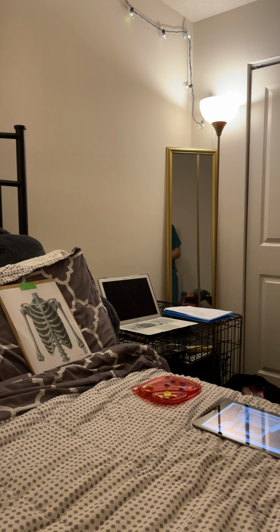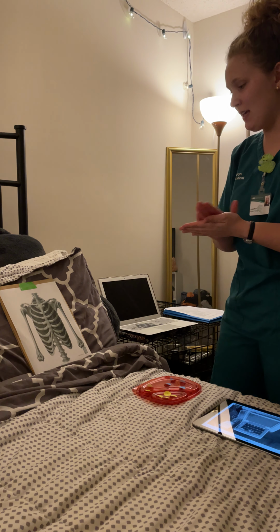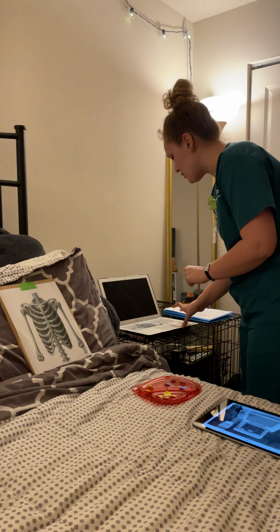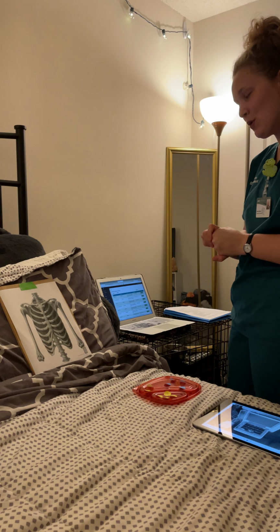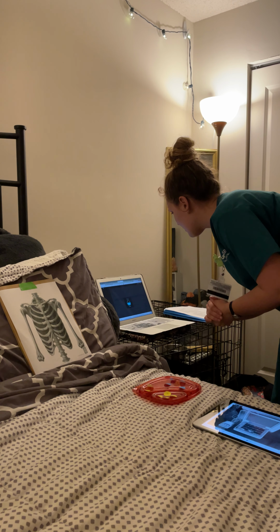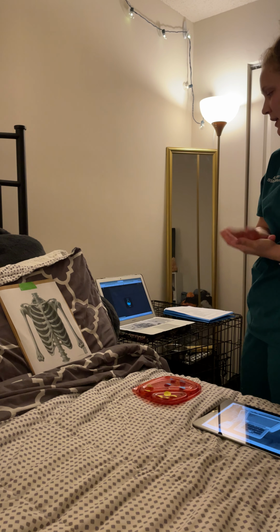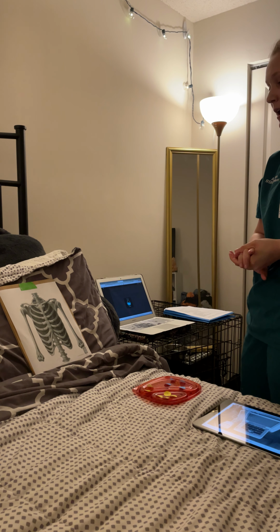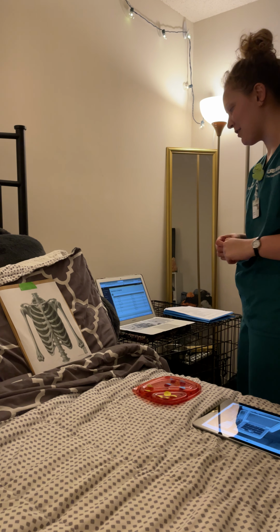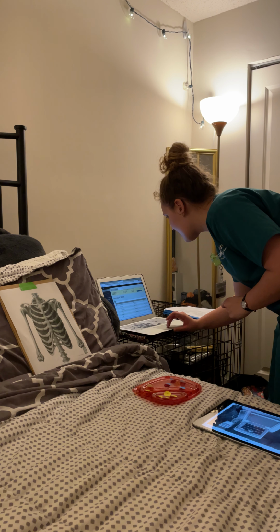Knock, knock, knock. Hello, Mrs. Gee. I'm Molly. I'm going to be the nurse taking care of you today. I am going to look in my computer real quick, and we'll get you started. I'm here to do an EKG, a 12-lead EKG on you today. You probably had one when you first came in, but we're doing another one today. So I'm just going to check the MAR.